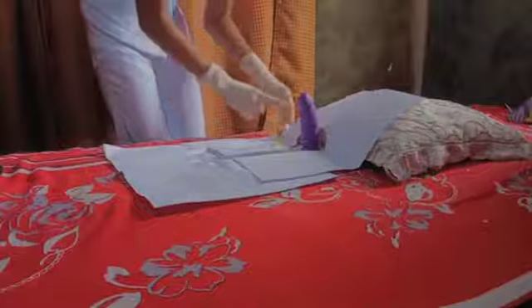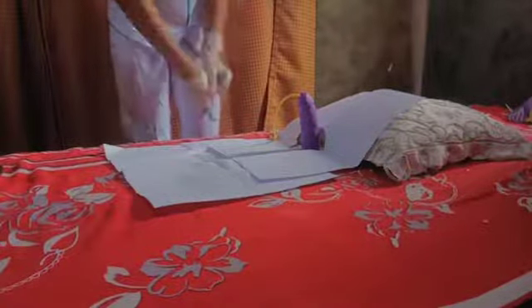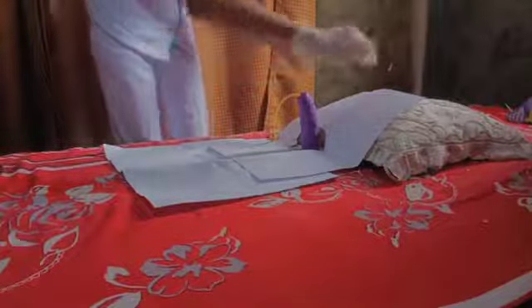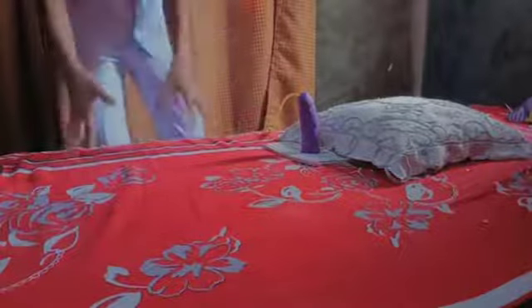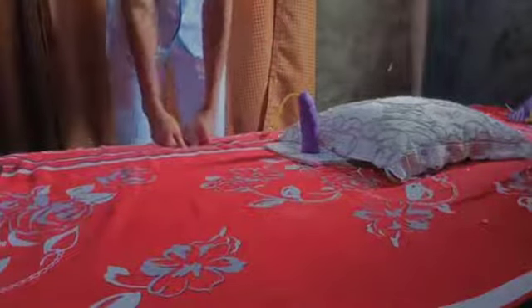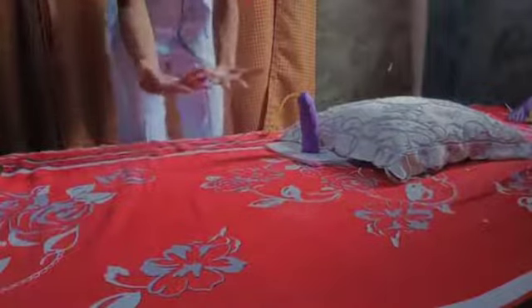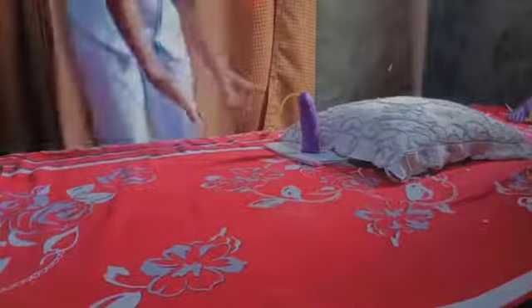Next, I will be removing my gloves. I will first remove the drapes and the pads, then my gloves. After that, we will assess our patient in a comfortable position, draping them and covering the genitals. Next, we will document the catheterization procedure, including the date and time, the catheter size, the client's reaction, and the amount of urine.